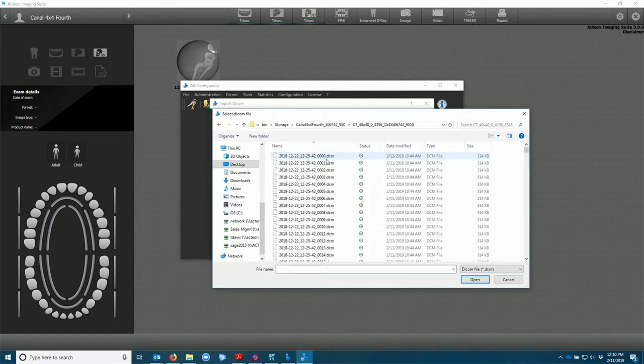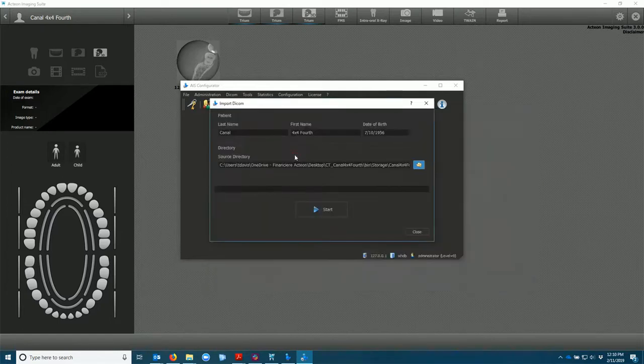Once you get to the DICOM files double-click and select start.